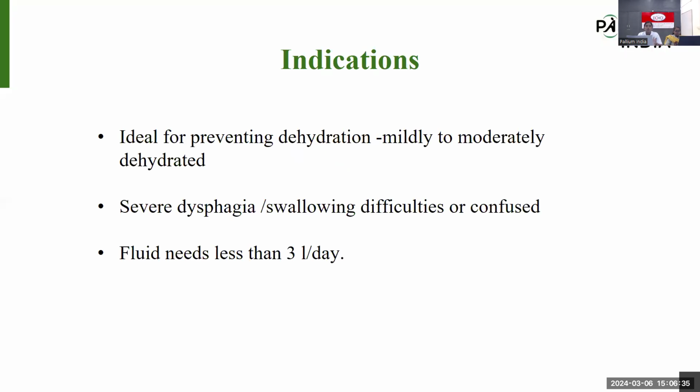And what are the main indications? Is there any indication for starting subcutaneous infusion? We already discussed one indication. The main indication is that it is ideal for preventing dehydration. Mainly, we are treating mild to moderate dehydration through subcutaneous infusion. We are not treating severe dehydration through subcutaneous infusion.